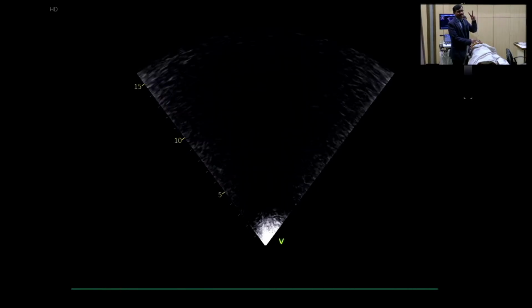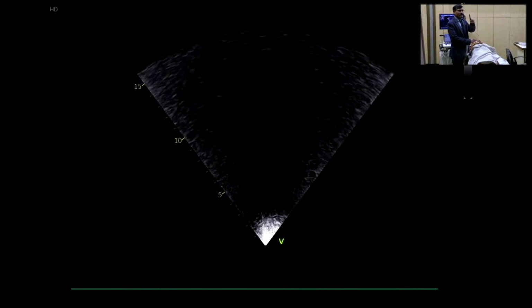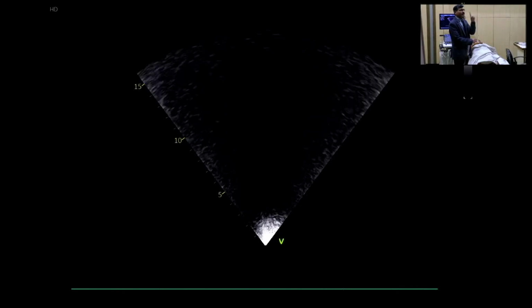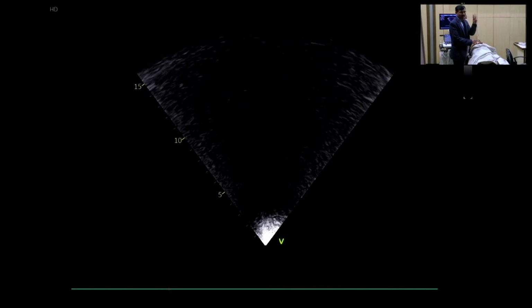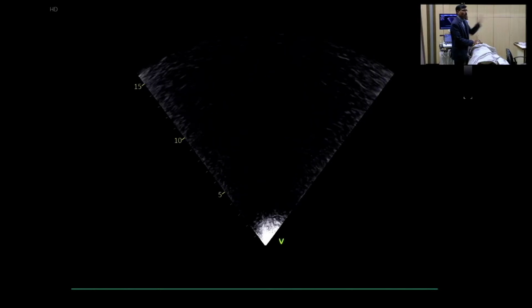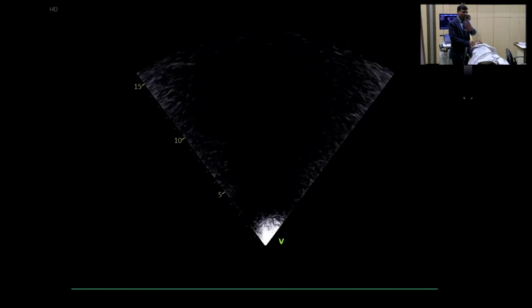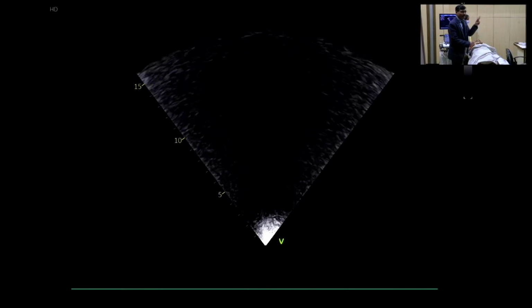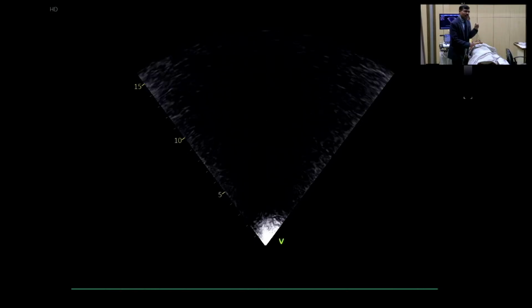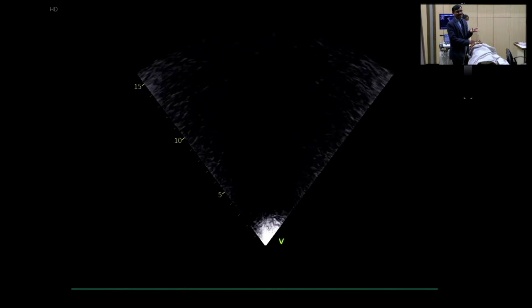Second, two. That's all is one DD, no? One DD is LSVC. Second possibility. In fact, there are three, but I am asking for only two. DD. One is LSVC draining into coronary sinus. Bilateral SVC, PLSVC, whatever you want to call it. All is the same thing. Second, so what else can drain into coronary sinus? That will give the answer. And chocolate is ready.